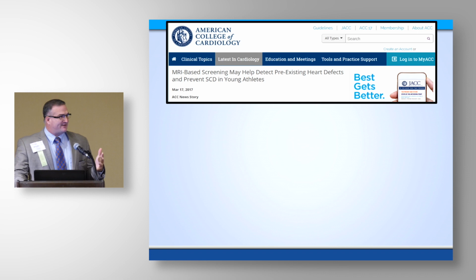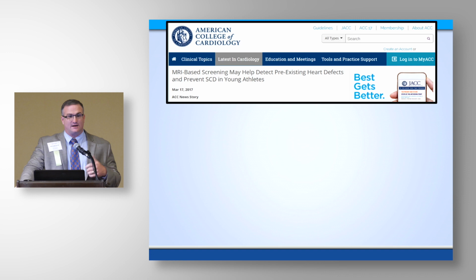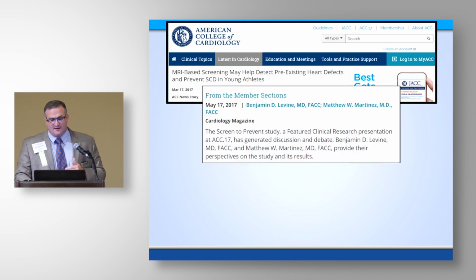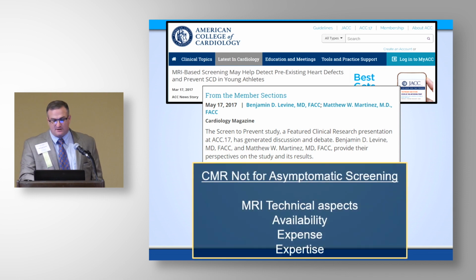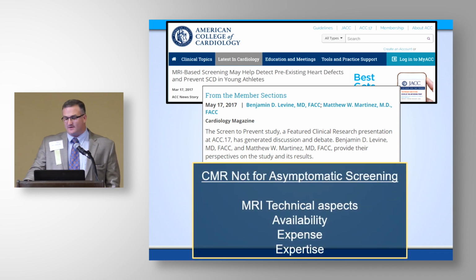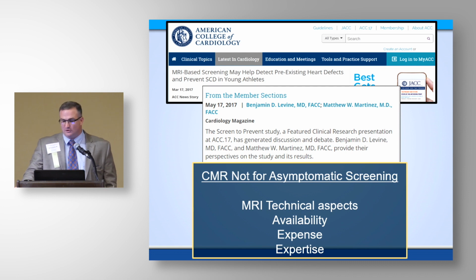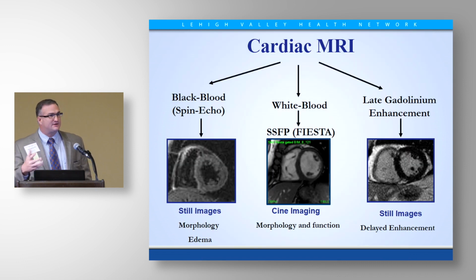So recently, the ACC, I feel like I have to address that. There was a discussion about asymptomatic screening using MRI. It got a lot of press, and whether or not we could just screen athletes using MRI. And Ben Levine and I wrote an editorial about it and came to the same conclusion, that it's probably not ready for prime time. And based on some of the things here, like technical aspects, availability, expense, expertise, and interpretation, MRI is probably not going to be the screening test we're all looking for. So I would recommend against this for asymptomatic screening of athletes above the other things we've talked about. But it clearly has a role.